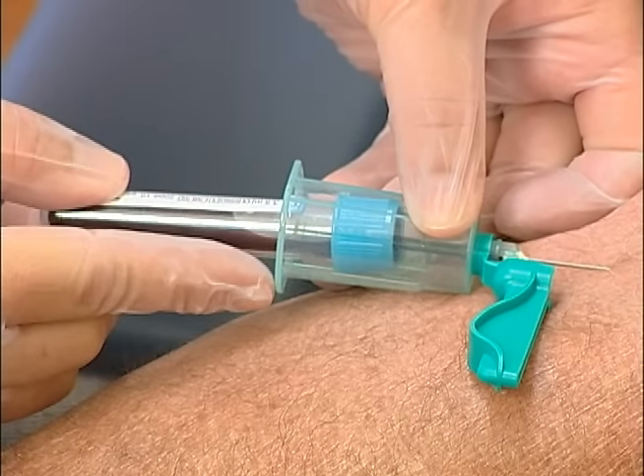remove it by grasping it between the thumb and middle finger and pushing against the tube holder with the index finger. Placing your index finger here prevents the needle from being pulled out of the vein while removing the filled tube from the tube holder.